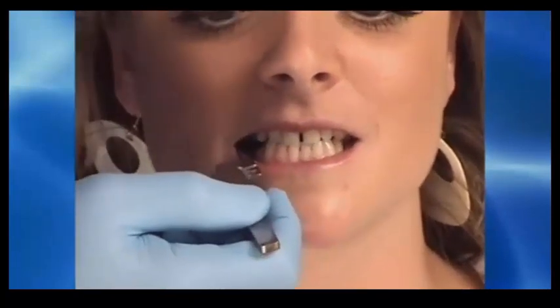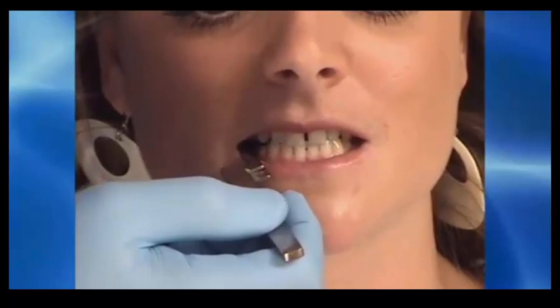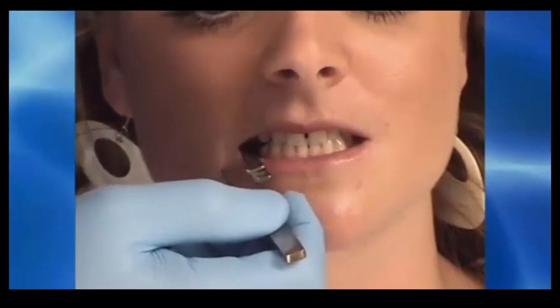Slide to the right. Go further. And back. And to the left. Try to go further. Good. Now slide back to the right. Try to go further. Good. And back. And to the left. And open.